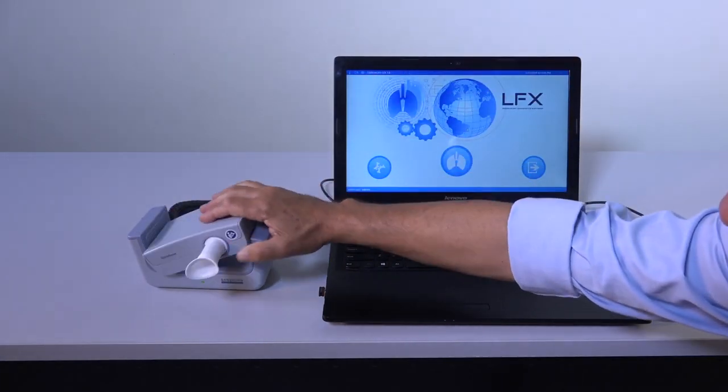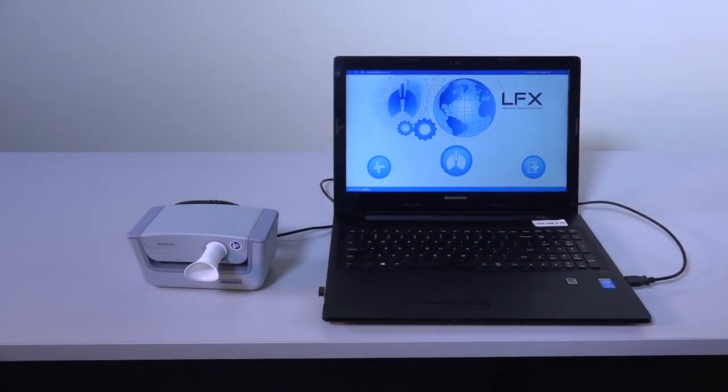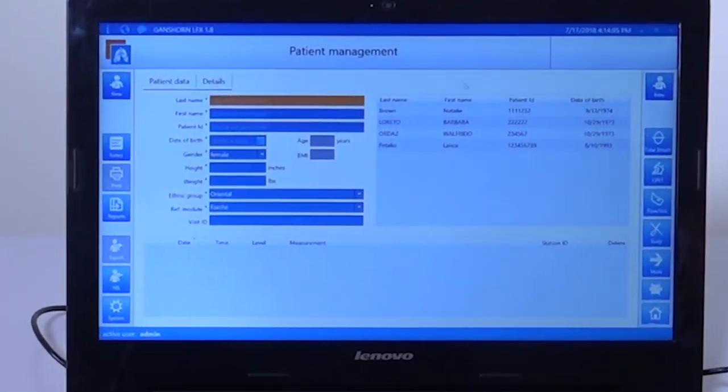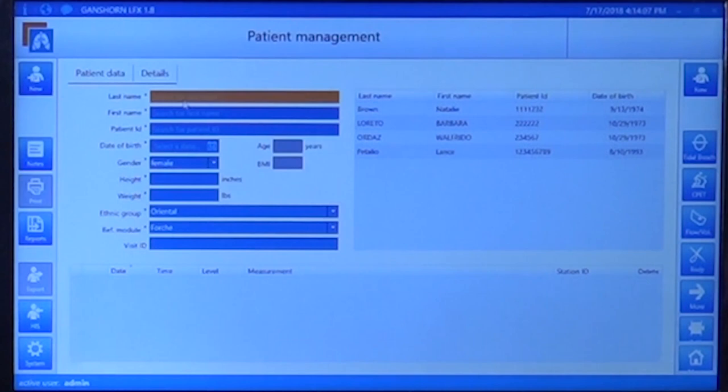The SpiroScout is PC-based and uses the LFX program, one of the most user-friendly programs available for spirometry. When you start work, click on the lungs icon in the middle and it will immediately open your database, which will have all the patients you have already tested. If you need to add a new patient, just enter the new patient data here.